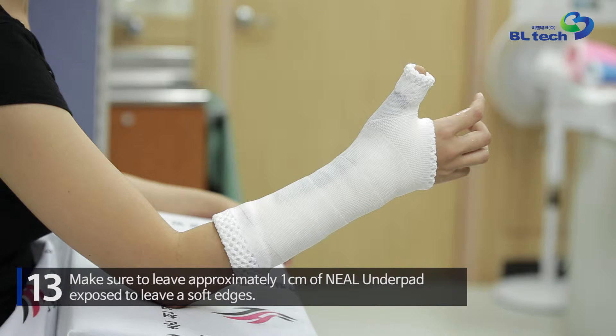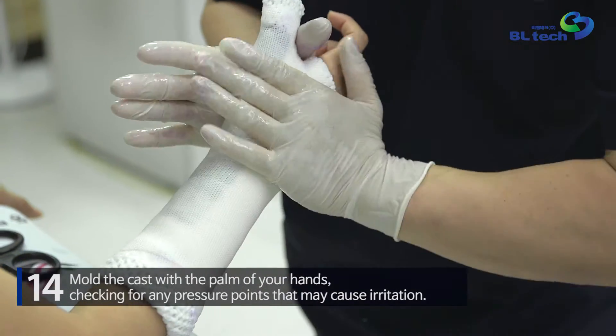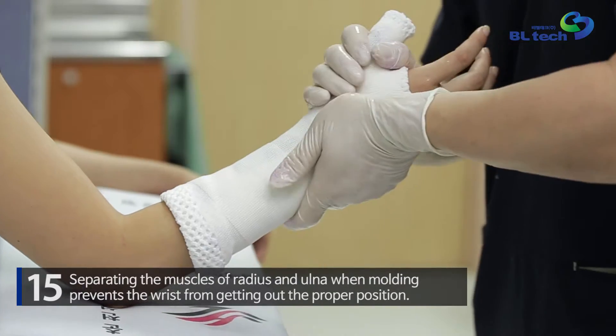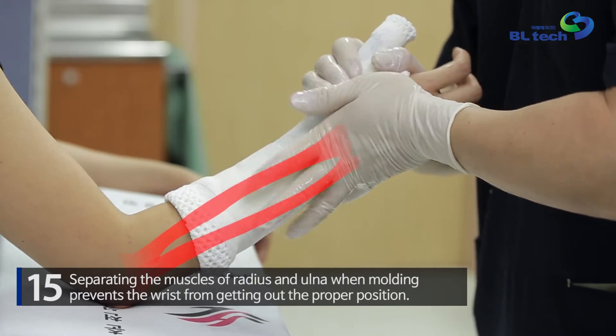Take care that the edge of the casting tape does not touch the patient's skin. Mold the cast with the palm of your hands, checking for any pressure points that may cause irritation. Separating the muscles of radius and ulna when molding prevents the wrist from getting out of the proper position.